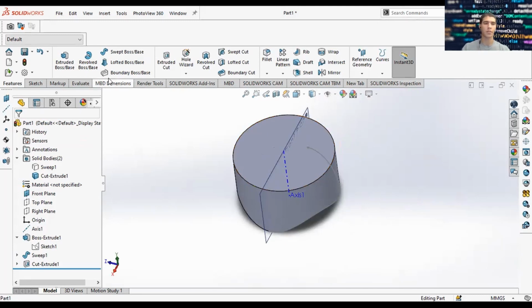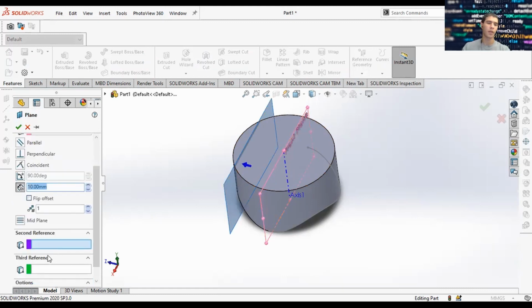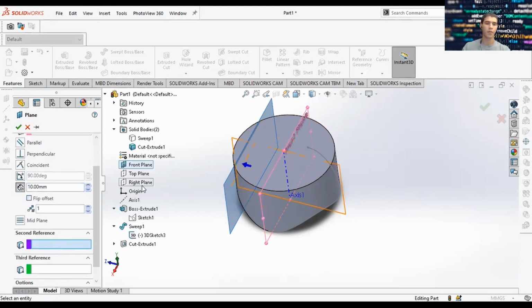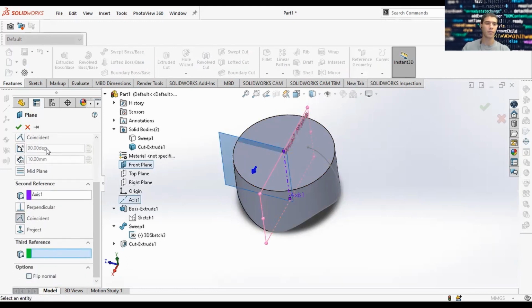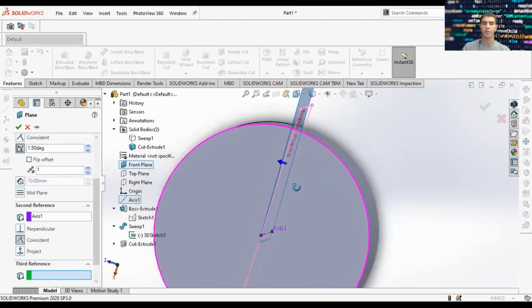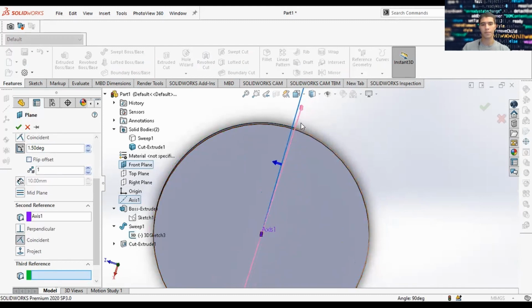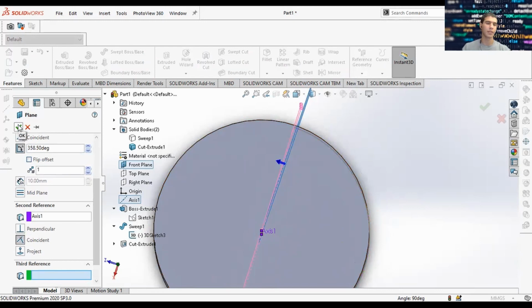So this is where the axis comes in. We declare front plane, and then we declare our axis. And then we just find the appropriate angle for it. In particular, we want it to be 1.5 degrees off from the axis. So it should be 360 minus 1.5, 358. Yeah, that's fine.